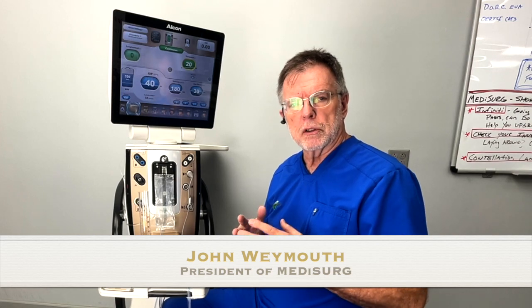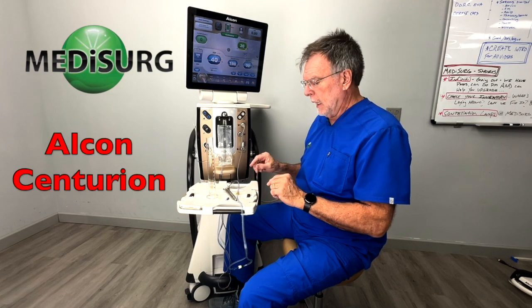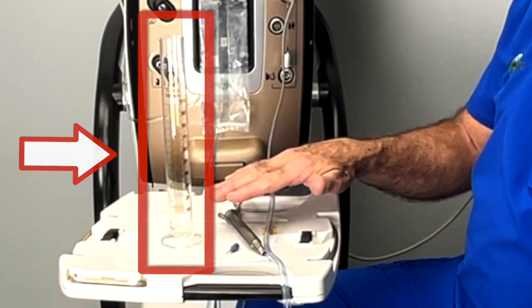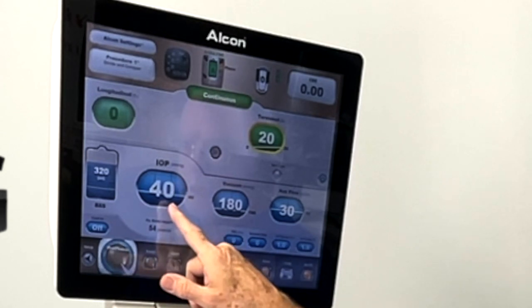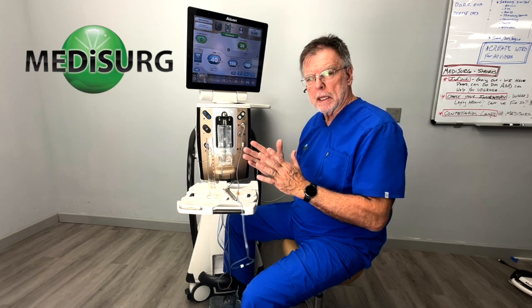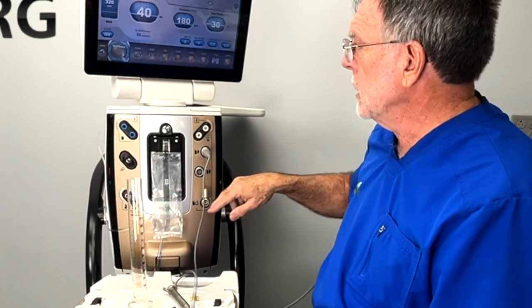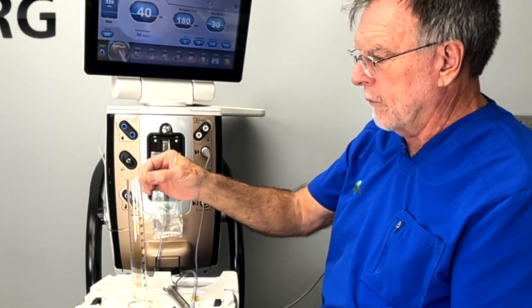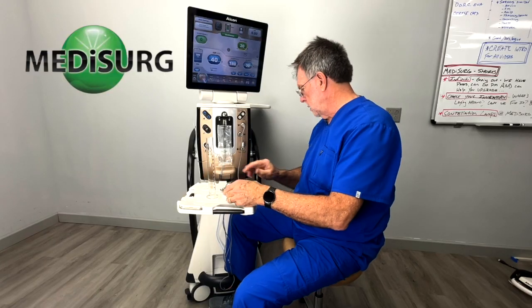We're going to be demonstrating flow through the phaco system. I have set up the Alcon Centurion, already primed and ready to go. I have my graduated cylinder to time and measure how much flow per minute we get from the system. I've set up my pressure on this unit to 40 for intraocular pressure, though it will vary depending on restriction of flow. My patient eye level is set to zero, right about even with the 100 mark, and that's where I'll have the tip of the tubing placed.